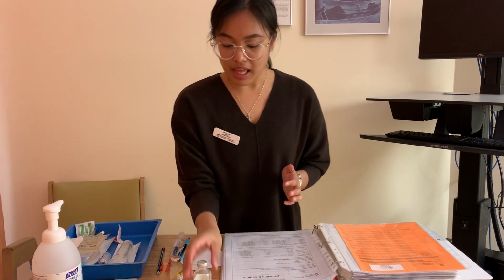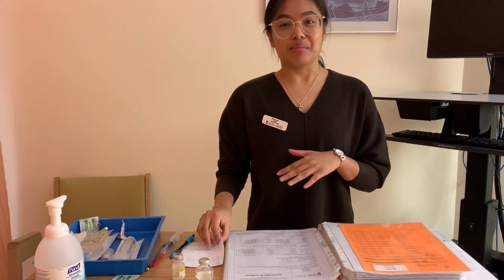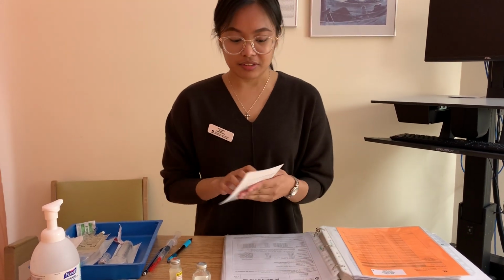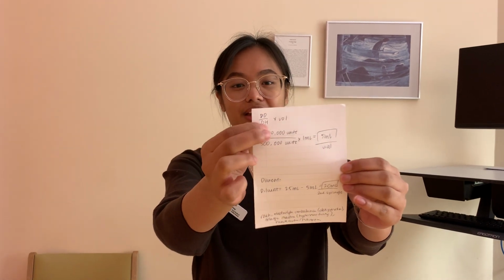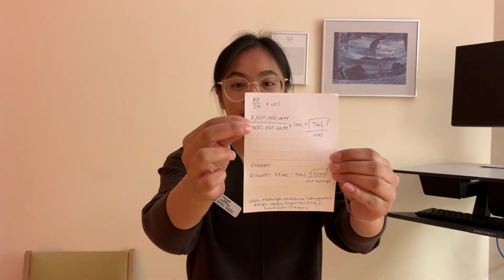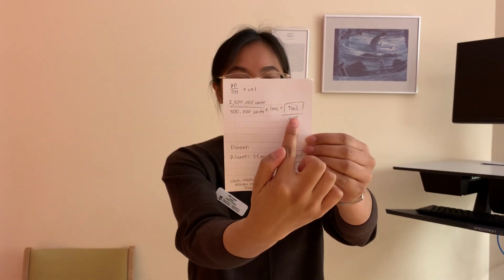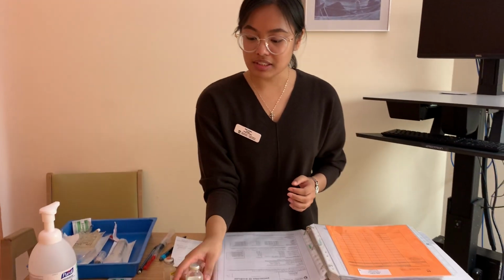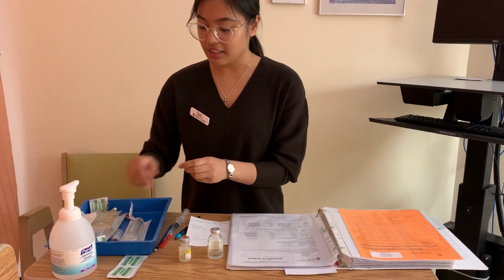And for reconstitution, I've already done my calculations prior to the skills demo for the purpose of this video. So here I have dosage divided by dosage on hand. So I needed 2.5 million units divided by my concentration of 500,000 units to give me 5 mLs that I have to pull up. So I don't know if this has been contaminated, so I'm going to quickly swab for 30 seconds again and let dry for 15.